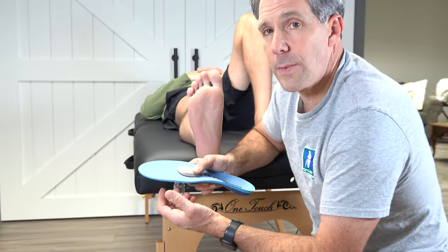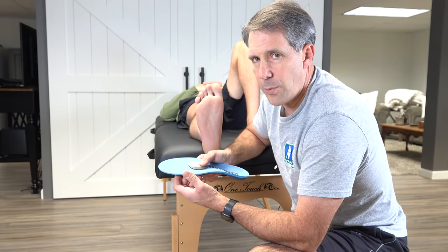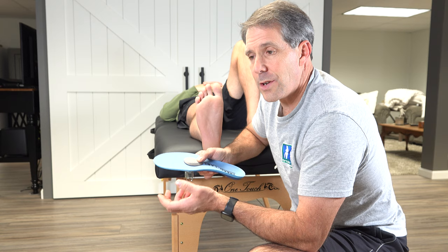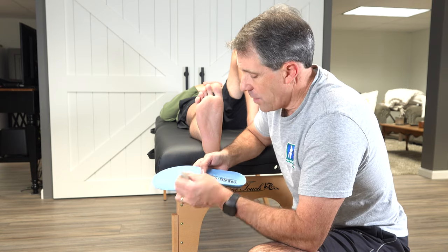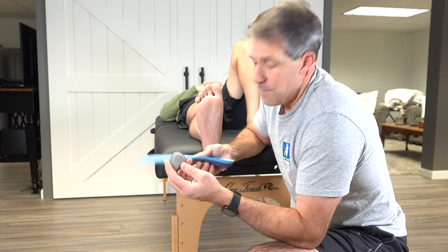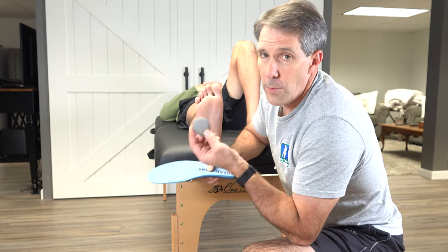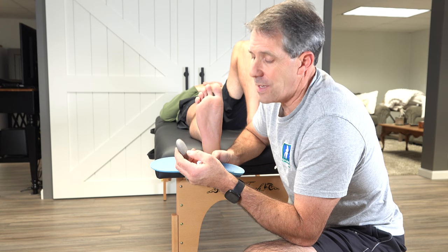I often do custom orthotics, but they can get a little bit pricey, and we put those exactly where they need to be. But when you can't get into a custom orthotic, I've gone to the Tread Labs only because they're super durable and they have a removable metatarsal pad that comes in different sizes.